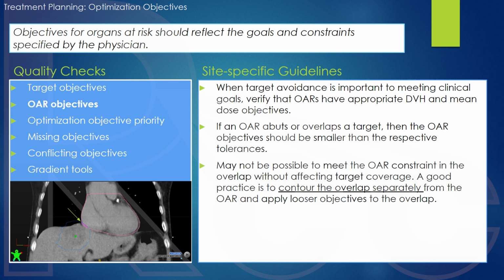In general, we want to follow the principles of ALARA, but more specifically, the literature that you want to reference is HyTEC, or the clinical trial protocols, in order to know the clinical goals for these organs at risk. These goals are absolutely different than with conventional RT. They are not the same. So HyTEC stands for Hypofractionated Treatment Effects in the Clinic.